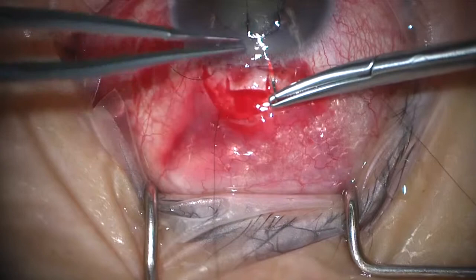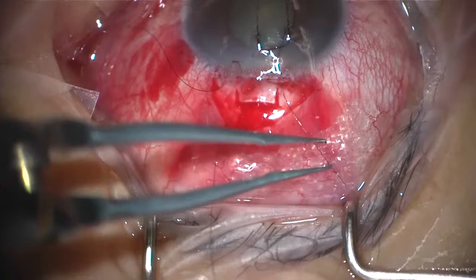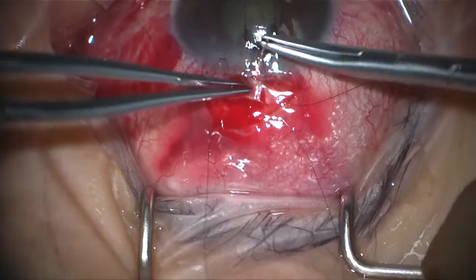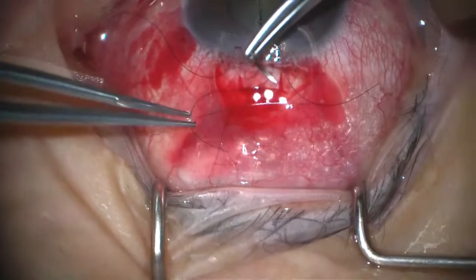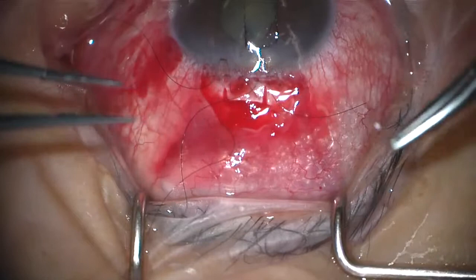Same on this side, temporal to the flap, through the groove, and then this end we lay the suture over there. Made the loop there, so that can be removed later. Partial thickness in the little flap, and then out in the corner. Got the loop there to tie the releasable suture.